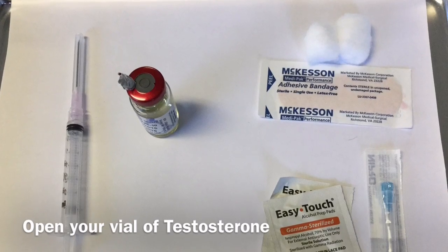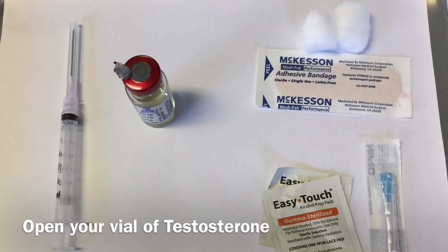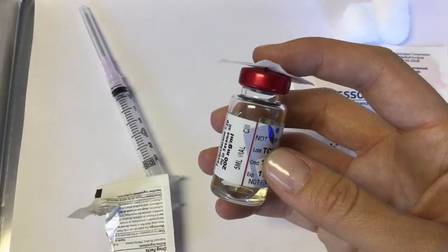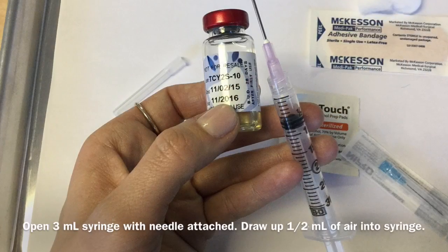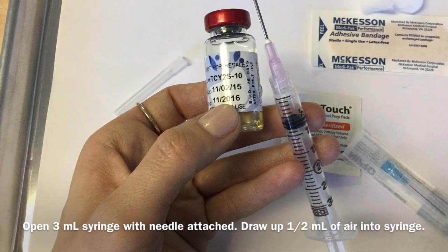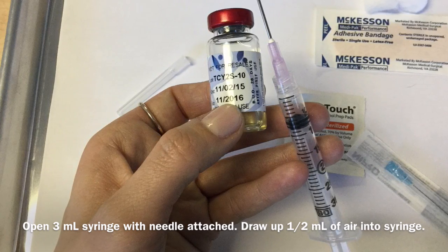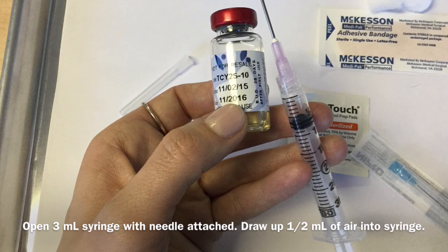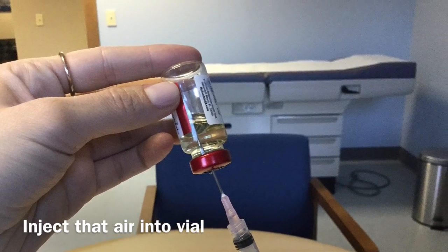Next, you'll go ahead and remove the little metal cap that's covering the vial stopper of your testosterone vial, and clean it with an alcohol wipe. Next, take your syringe and draw in just about a half an ml of air into the syringe, and inject that into your testosterone vial. That'll make it easier to draw the testosterone up into the syringe.